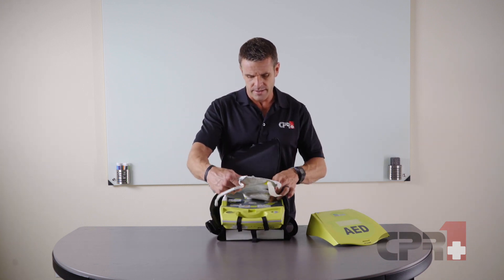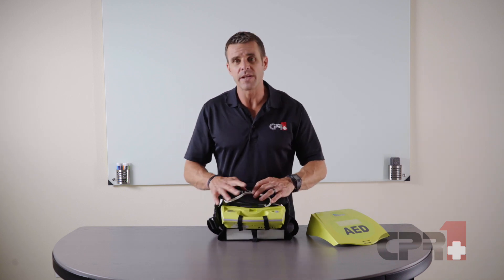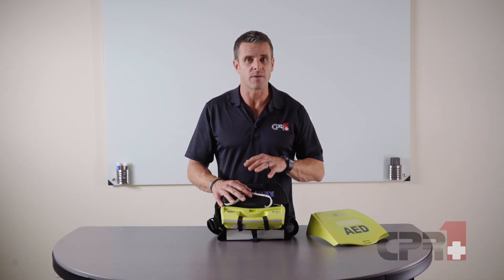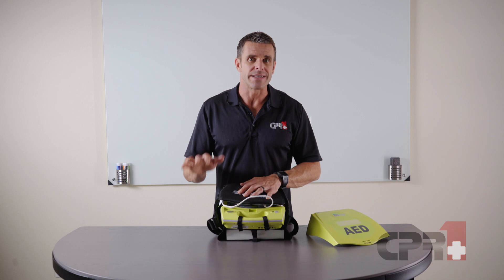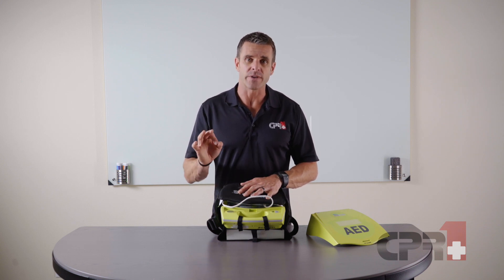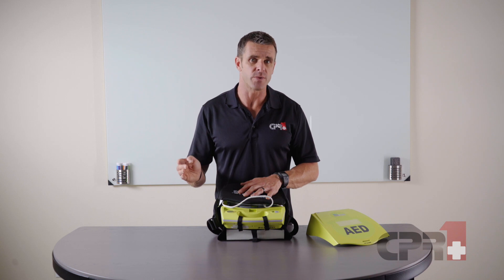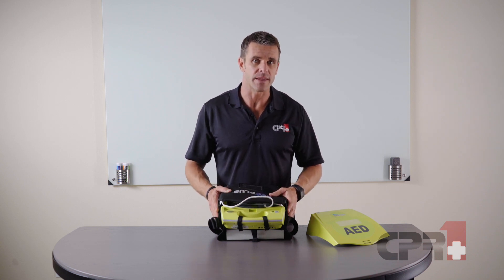Zoll is known for its real-time CPR feedback technology. Once the pads are placed, there's a sensor — we call it the hockey puck — in the middle of the chest that measures the depth and rate of our compressions, helping us stay in the sweet spot of 100 to 120 compressions per minute at 2 to 2.4 inches in depth.